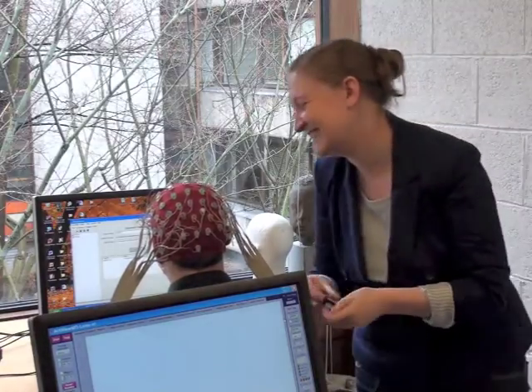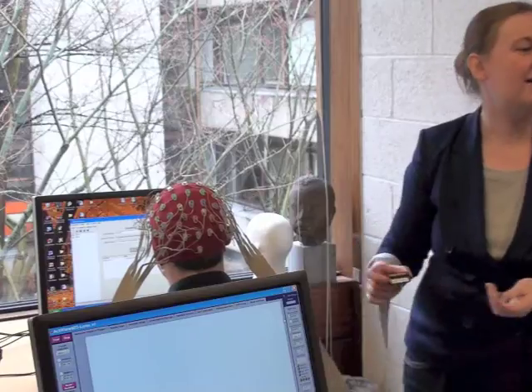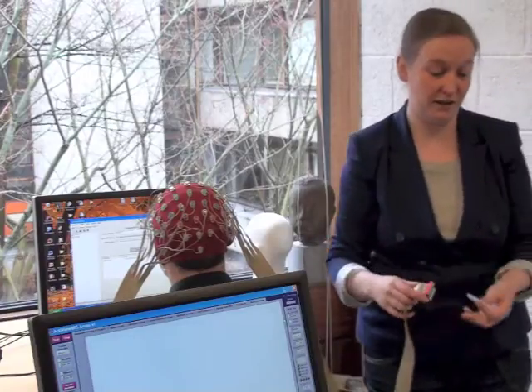Sorry, just as you mentioned every single one of those things, I've wanted to do them. I was going to say, when you do mention it, does that not make people want to do it more? Well, I usually should have told them before, just before our session. It's only now that they can be blinking and doing this stuff. It's when I start recording that it will affect it.